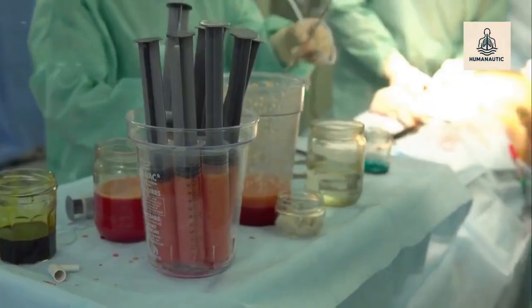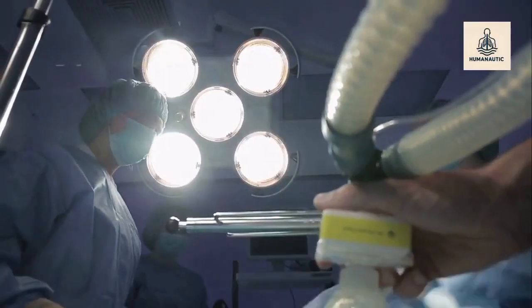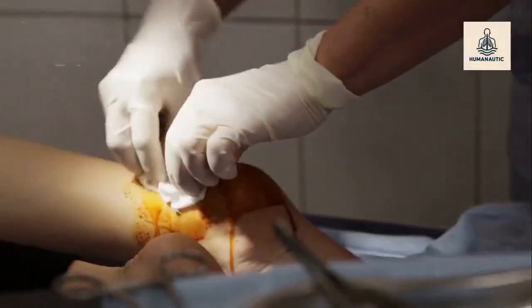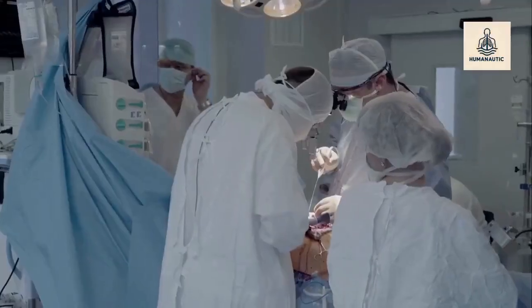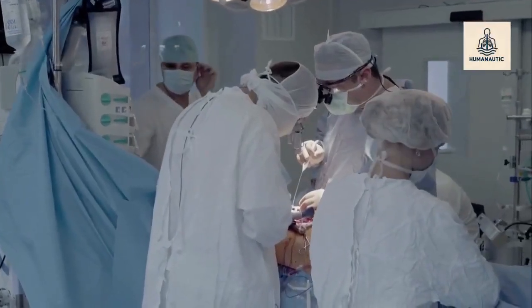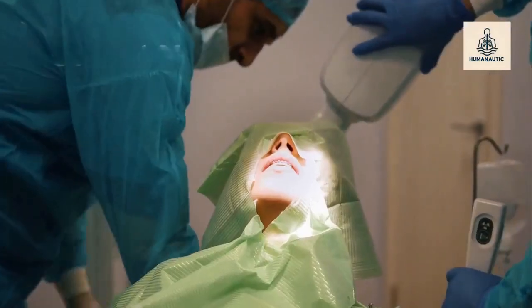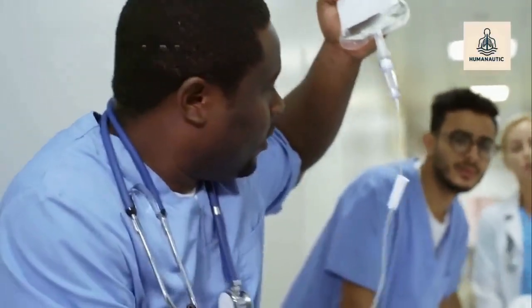Step-by-step surgical wound debridement. Step 1, patient preparation. Obtain consent. Examine wound size, depth, and infection. Ensure adequate blood supply. Step 2, anesthesia. Local anesthesia for small wounds; regional or general anesthesia for larger wounds.